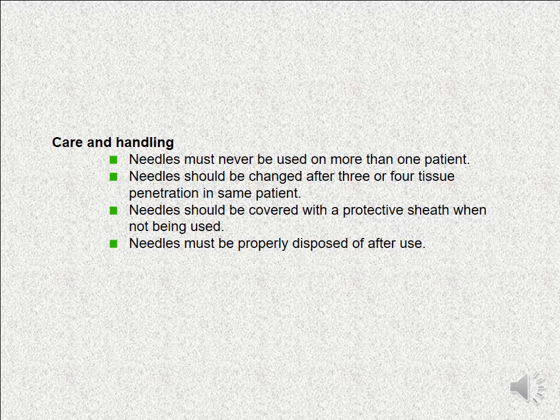We can sterilize by autoclave, but it is difficult to clean inside the needle very carefully. So use a disposable type of needle, used only once for one patient. The needle should be changed after 3 or 4 tissue penetrations in the same patient.